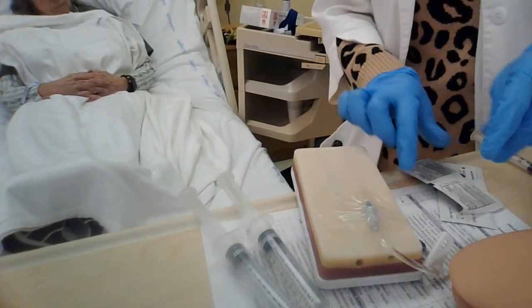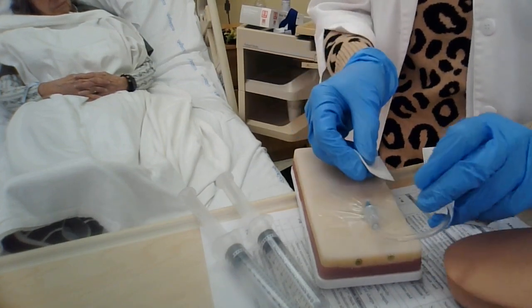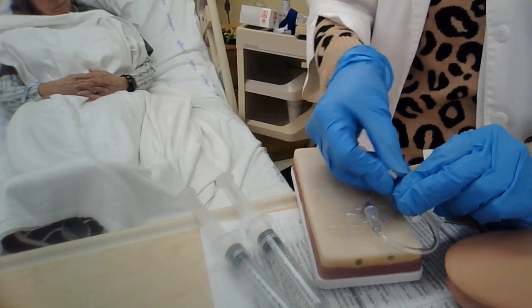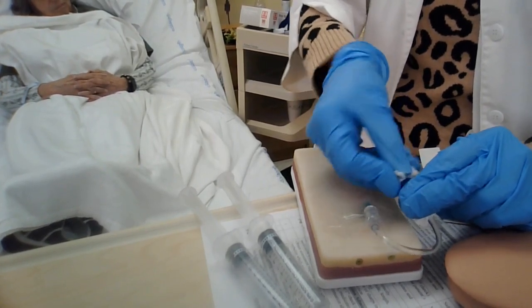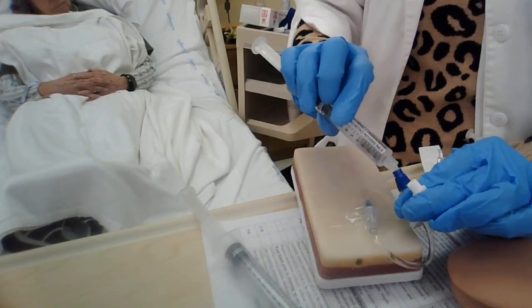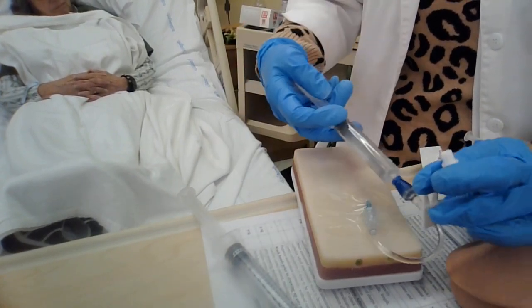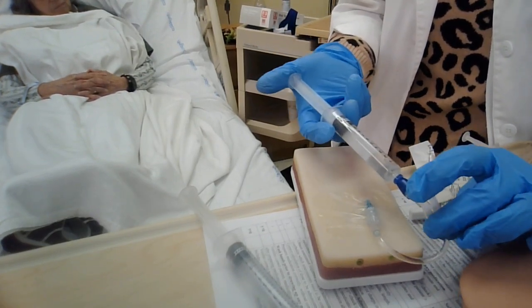Okay? So first things first, every time that you access the line, you need a new alcohol swab, and you're going to at least 5 seconds scrub the hub. And we do that to prevent any infections. Okay? So I'm going to go ahead and connect my saline, and I'm going to flush at least 3 to 5 milliliters to ensure that that site is patent before I put any medicine in it.